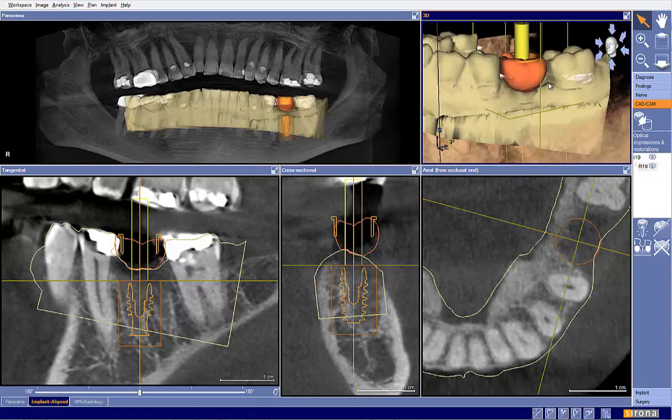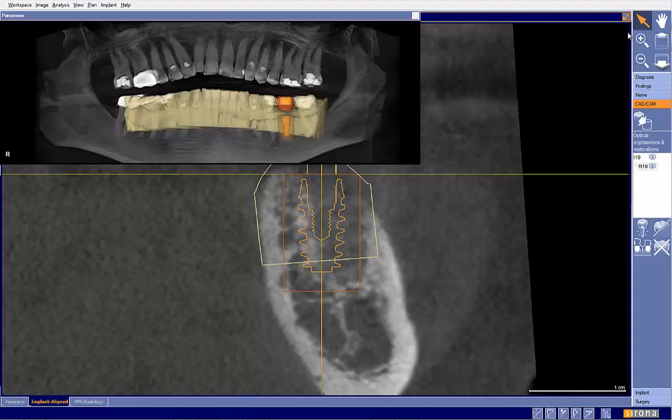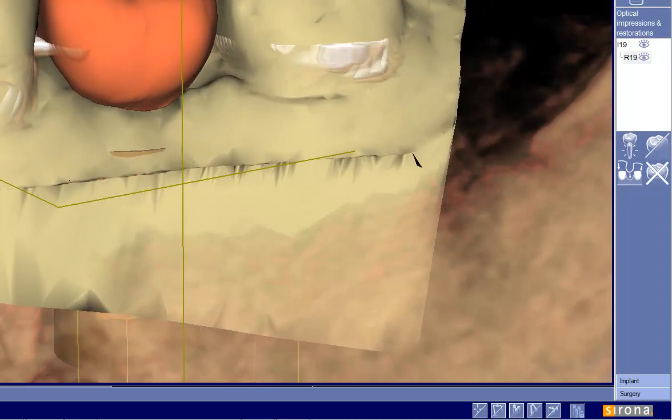If I were to take a look here, the other thing that I see is that our emergence would be, if that's the margin that you want, our implant is outside of that emergence, making this a little bit more difficult to achieve. So my question is, one, is that what you really want? And then two, was this case planned properly on the CEREC side? And I would say in this particular case, not exactly.